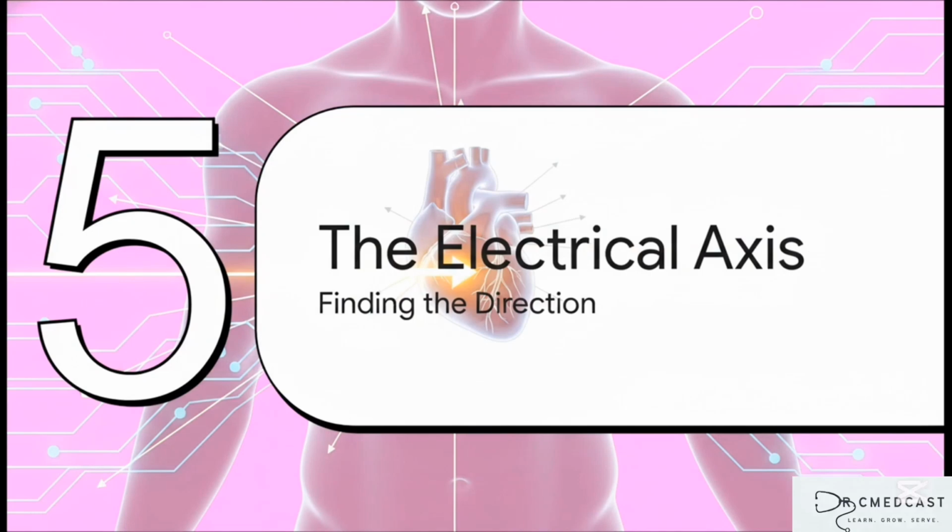Okay, let's shift gears now to a slightly more advanced concept. By taking all the information we get from our different cameras, our multiple leads, we can actually figure out the overall, or average direction of the heart's electrical energy. And we call this the electrical axis.